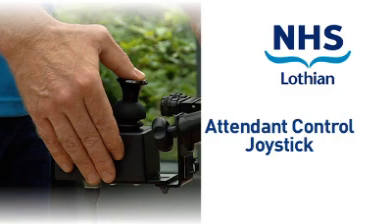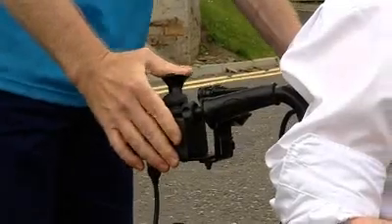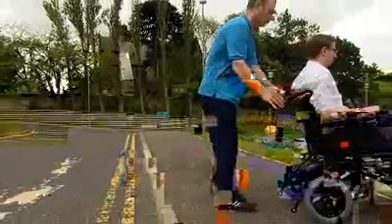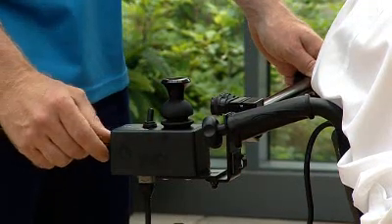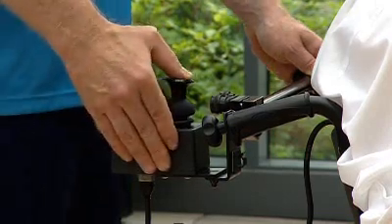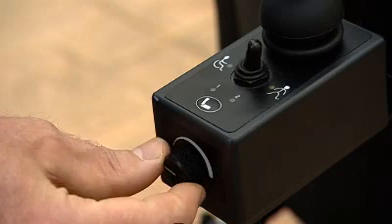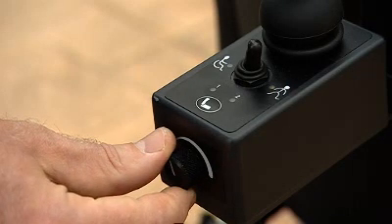Attendant control joystick. The attendant control joystick enables an attendant to drive the powered wheelchair, controlling both speed and direction. The speed of the powered wheelchair will vary depending on the level of speed selected on the controller and the joystick movement. To increase the speed on the controller, turn the knob to the right, and to reduce the speed, turn the knob to the left.